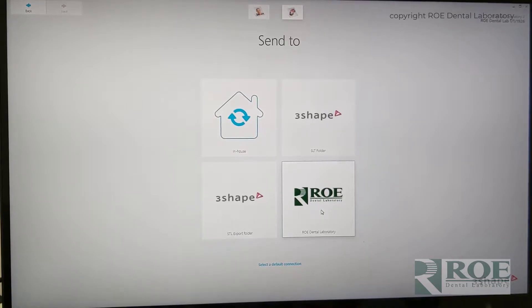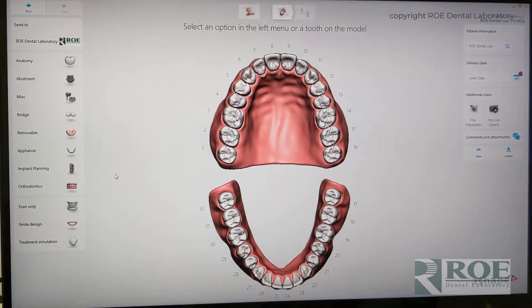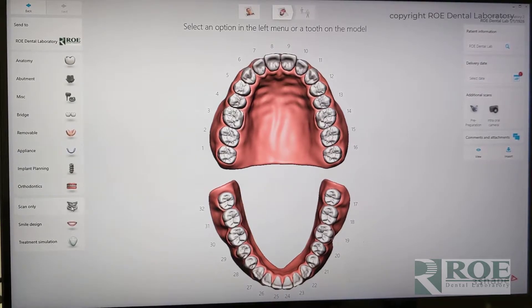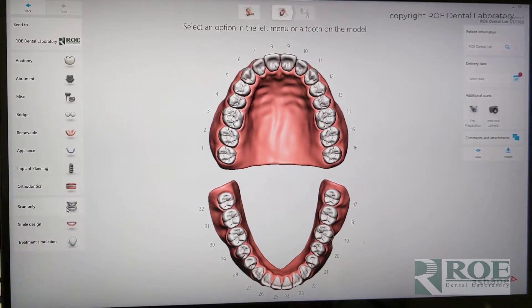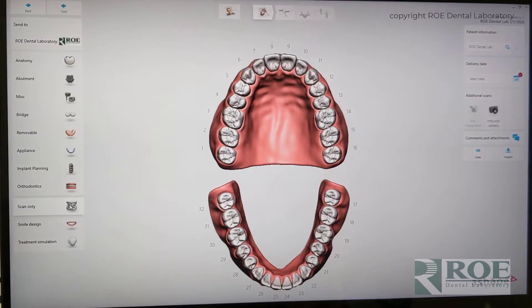Generally, when we scan here at the laboratory, we pick scan only. We don't want to tell the system that it's a particular implant or a tooth or anything like that. We just want to do scan only down here. And all we're going to do is scan the arch — in this case, a maxillary arch. We're going to scan the arch only and send to the lab.